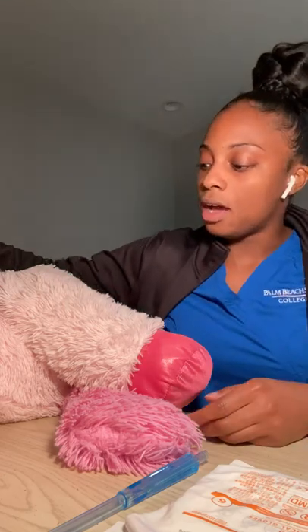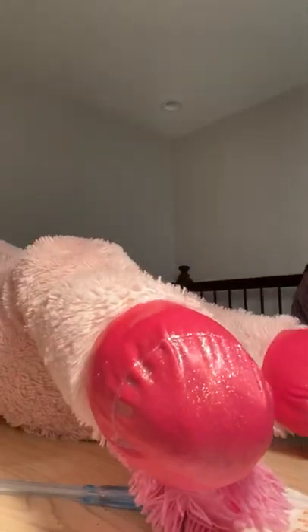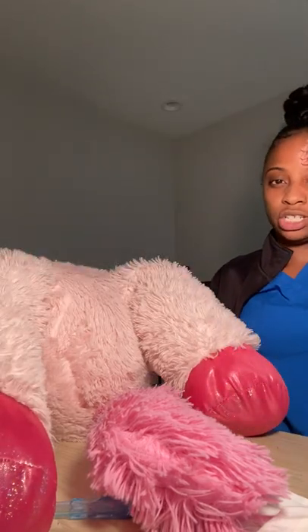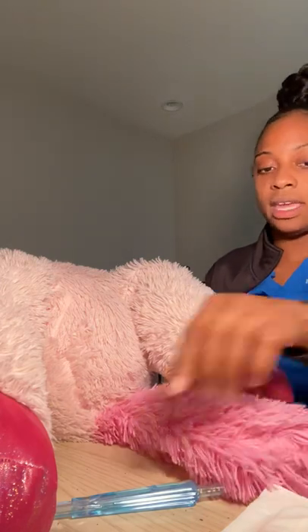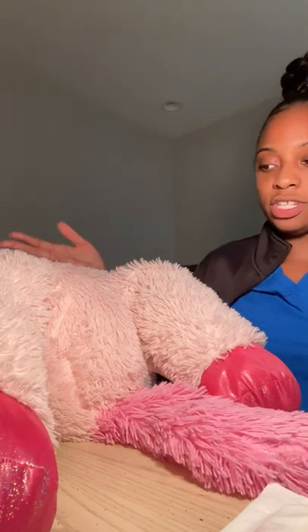Before the doctor gets in, I'll go ahead and make sure I'm positioning my patient. She's going to have her legs opened up. I'm going to go ahead and put some chucks underneath her. At this time, you would want a lot of chucks underneath because it's going to be leaking and there's going to be a lot of fluid to keep it from getting on the bed. My doctor's here at the bedside and he's going to be performing the rupture of the amniotic membrane.